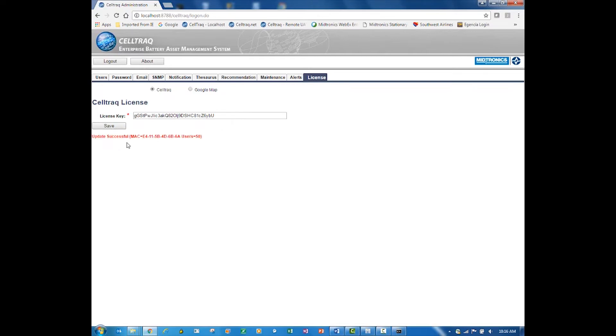Here is where you would copy and paste that license key that Midtronics sent you back, and then just hit Save. It'll tell you it was successful if you had that correct MAC address. It'll recognize that it belongs to that machine and tell you it was successful for the MAC address and the number of users that you purchased.